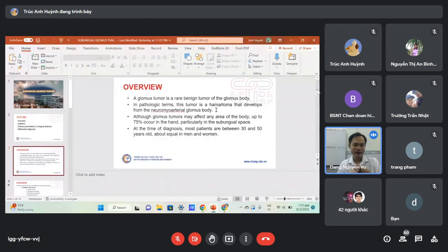But I think that when you do ultrasound, you think of the diagnosis. You already have the diagnosis before you do the ultrasound scan. The majority of patients come to us with a problem with the nail. Usually the patient experiences MRI scan, so that's why I'm a little bit surprised the patient only did ultrasound without any MRI scan. This is okay. Very good of you to pick up the lesion under ultrasound. That is really nice.